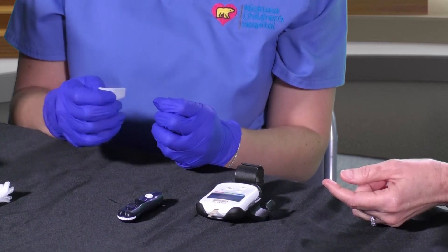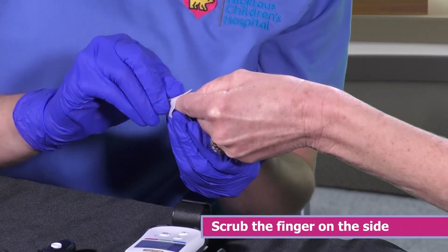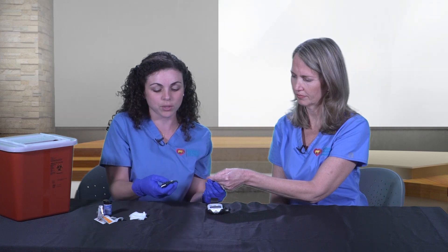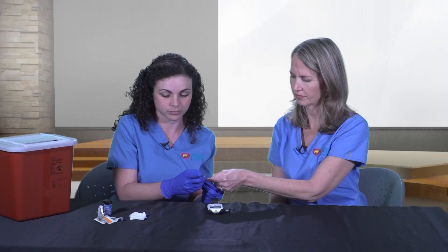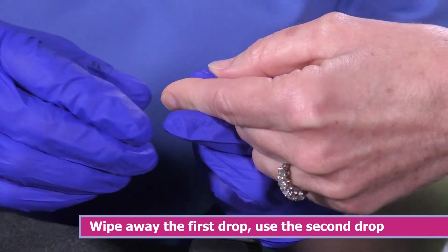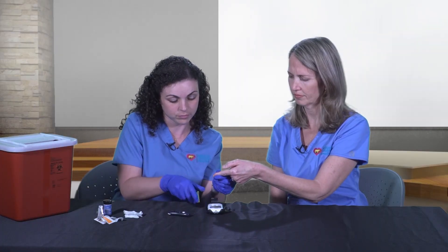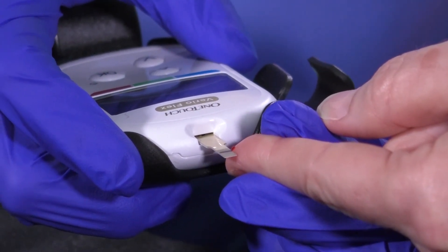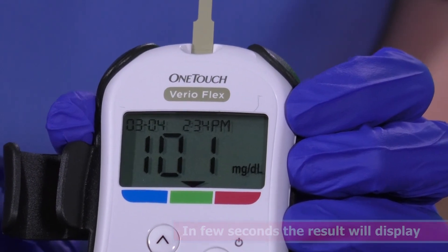Now you are ready to clean your child's finger. If able, please allow your child to choose the finger where they would like their test done. Scrub the finger on the side, as the sides have less nerve endings and are therefore less painful. Place your lancet device on the side of your child's finger and press the button. Wipe away the first drop and use the second drop by applying pressure to your child's finger. Grab your test strip inserted into your glucometer and tap the drop of blood — it will suck it right up. In a few seconds you will have a test result displayed.